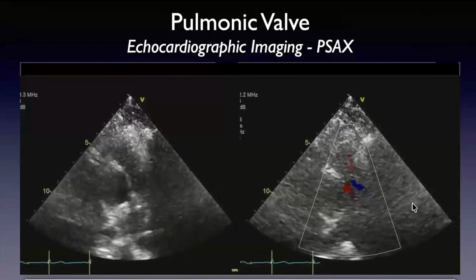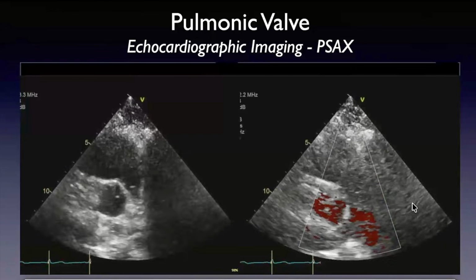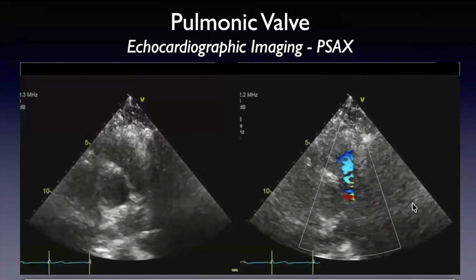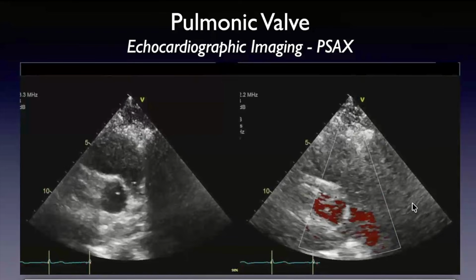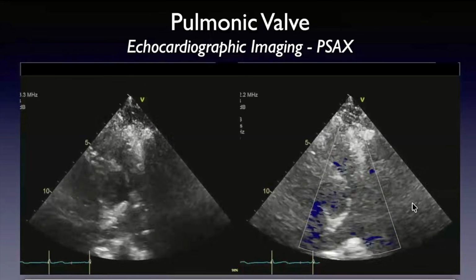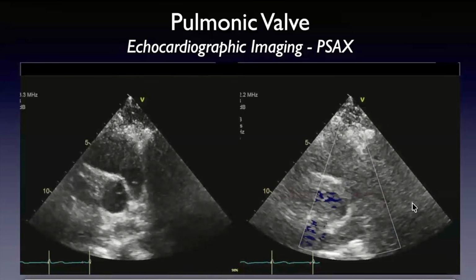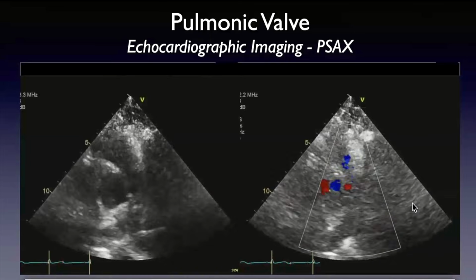And of course, we sample both pulse wave Doppler of the RVOT and continuous wave Doppler through the pulmonic valve. In our lab, the protocol usually is to do CW in both the parasternal long and short axis RV flow tract views, and do a pulse wave Doppler of the RVOT in at least one of those views, depending on which view the sonographer thinks is useful. I don't mind having it done in both views. For most labs, these are the standard views to look at the pulmonic valve. But there are actually a few other views to look at the pulmonic valve.